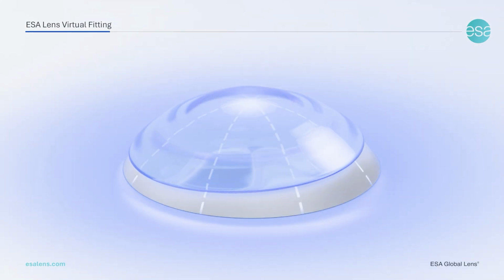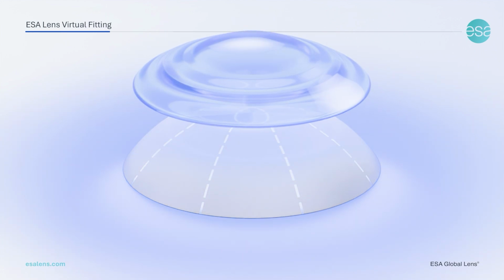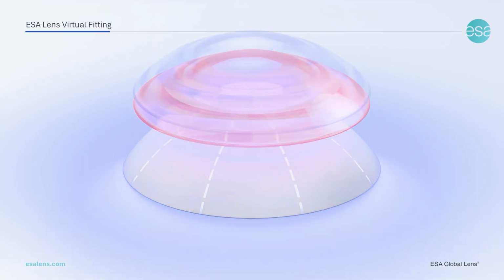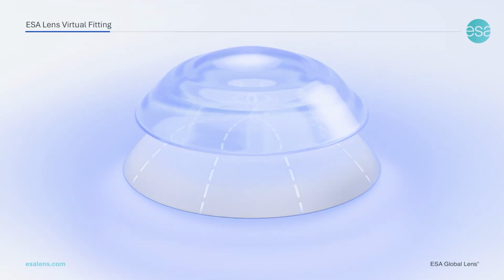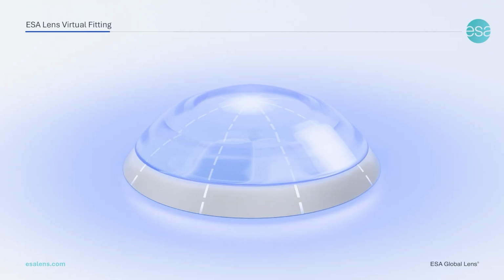Both platforms use 3D positioning of the ESA lens from a large virtual trial set of 10,395 back surfaces contained in the platform database. The program performs several hundred virtual fittings and then selects the best one to achieve optimal tear film thickness and central clearance. In addition, the platforms contain a calculator that allows you to accurately determine the impact of the selected lens.